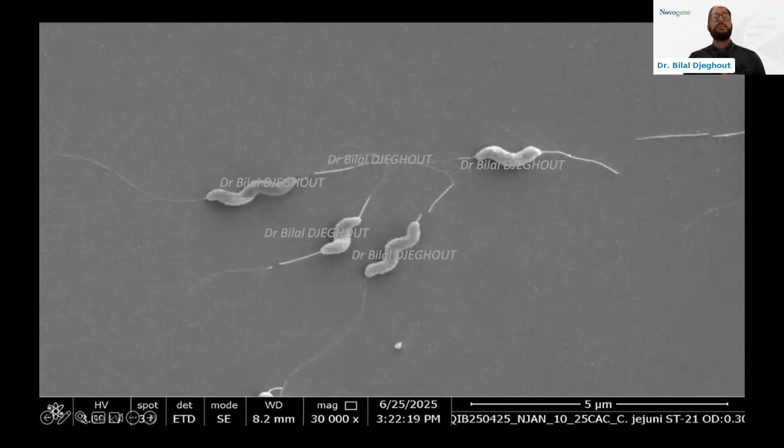This image is a high-resolution electron micrograph of Campylobacter jejuni. It was taken with our QIB imaging facility team. The bacteria's characteristic spiral or corkscrew shape is clearly visible, along with their long whip-like flagella that provide rapid darting motility. This unique morphology allows Campylobacter to move efficiently through the mucous lining of animal and human intestines, aiding infection. The small size, just fractions of a micron wide, makes detection and study of this bacteria challenging, especially in clinical samples.